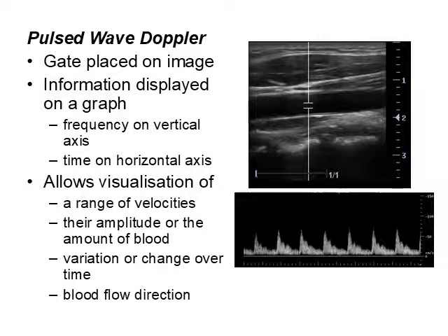The other thing this could be really good for is comparing how things change over time, because we're actually getting a figure, a number, that we can then use, say, when the person comes back in 6 months' time, to see if the numbers are the same or have changed. So it does give us a variable that we can use for comparisons.